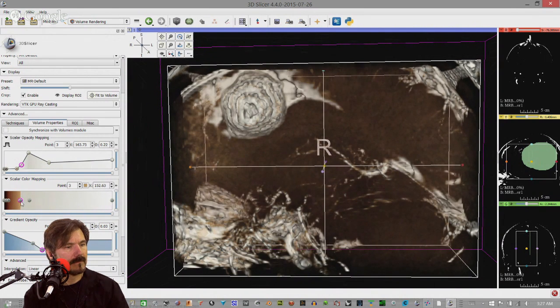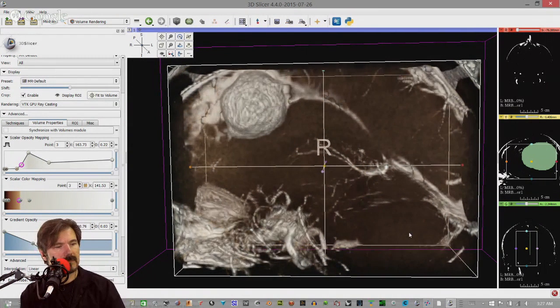It looks like maybe that's what it's highlighting there, all those structures that you're seeing, or if that same kind of MRI, it's what we had talked about before in terms of what the magnet's picking up. So it's interesting. And as we talked earlier, there are obviously different settings that you can do with an MRI. In my discussion with Dr. Scott Cleos, you have T1, you have T2, which are all part of the excitation of the magnet, the atoms themselves, and those levels.